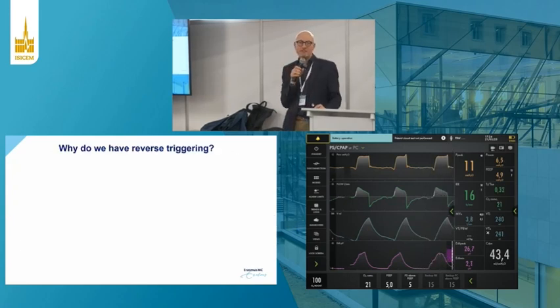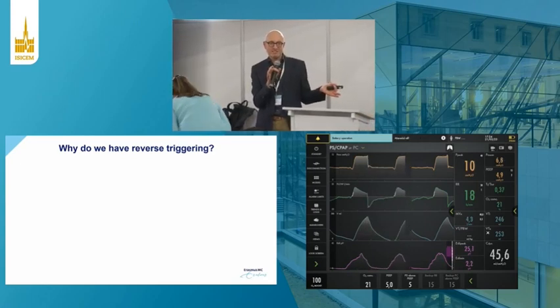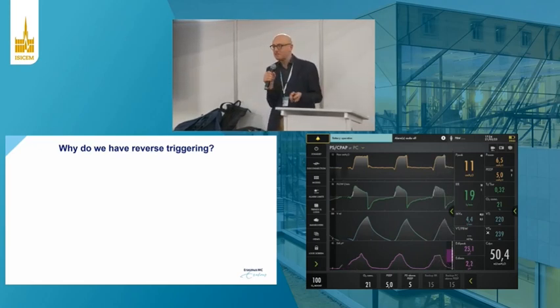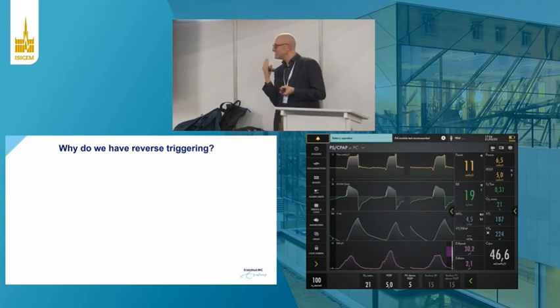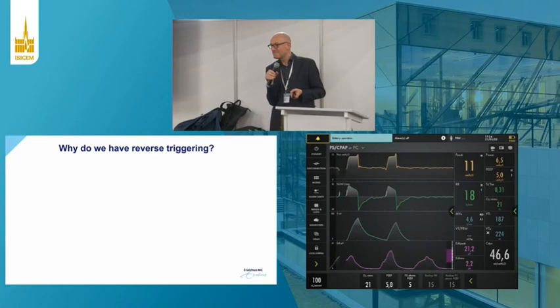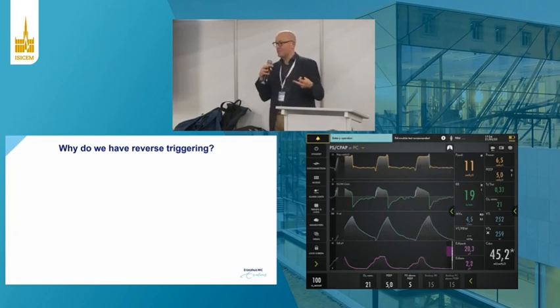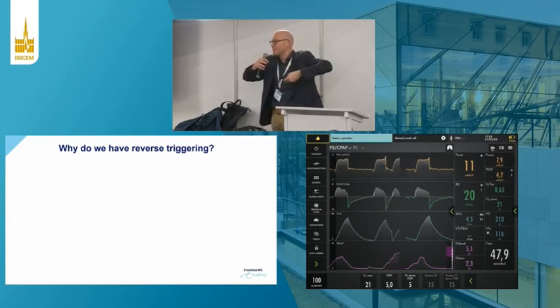So does anyone know why we have reverse triggering at all? From an evolutionary perspective, we were not made for being on a ventilator, right? So is there any reason for reverse triggering? Anyone has an idea? Why would there be a reason to synchronize your ventilation with external stimuli? Because that's what's happening, right? You're inflating the lung and you're activating your brain centers.